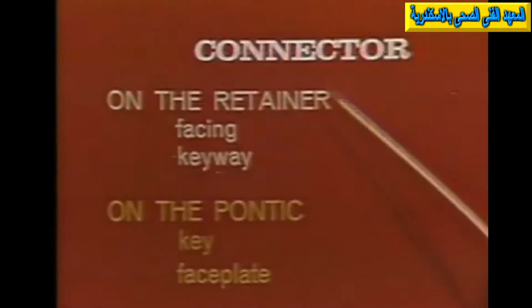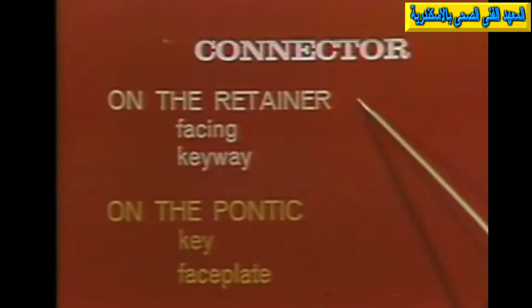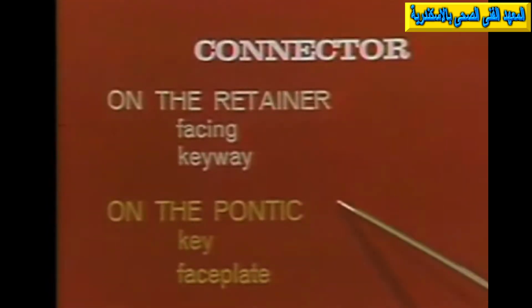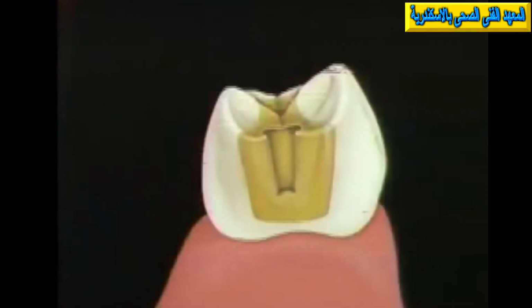Let's go back now to the question of the connector itself. And this really has two sets of areas to look at. First of all, those on the retainer itself, which consist of the facing and the keyway, and then on the Pontic, which of course has the key and the faceplate. Let's take a look first of all at the part on the retainer itself.